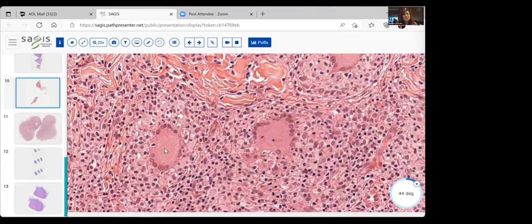Well, what they're trying to do is not only eat that, but typically they eat all the elastic in the area too. So sometimes you'll see elastic fibers with the lymphocytes in these large multinucleate giant cells. If you do an elastic stain in this area, it's typically showing you that all the elastic fibers are gone.